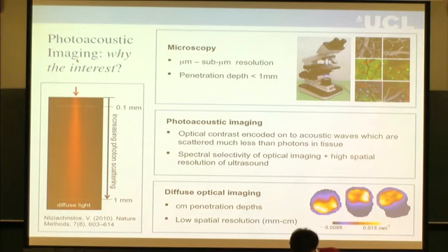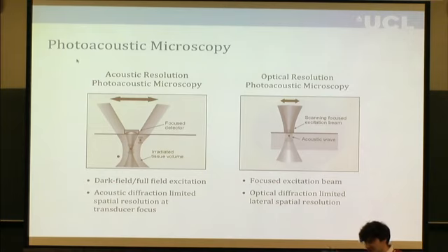On the next slide, I just want to talk about something I'm not going to talk about, if you see what I mean. So a lot of the literature, certainly in the last few years, in photoacoustic imaging, has been about microscopy rather than tomography. So there's a couple of different systems that have been worked on a lot, in particular by Li Hong Wang's group. He's the sort of king of photoacoustics experimentally. And they're called acoustic resolution photoacoustic microscopy, and optical resolution. So here, what they're doing is they're looking at quite superficial depths, less than a millimeter. And they focus, in this case, they're focusing their detector to a point or to a line, really. And then they just scan this acoustic detector across the surface. So they're not doing any reconstruction. They're not doing any maths.